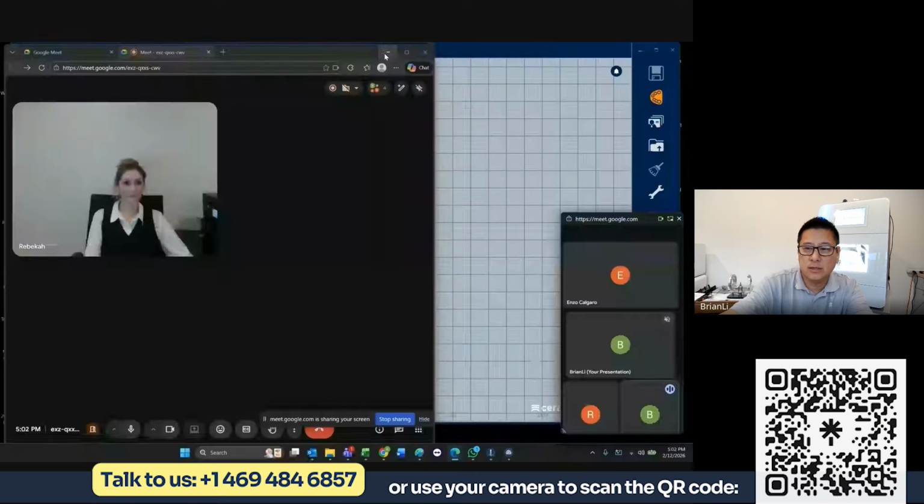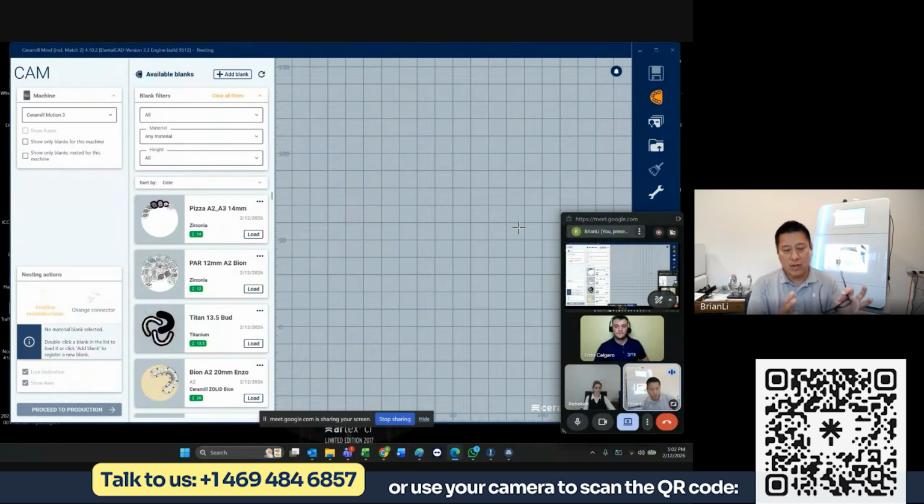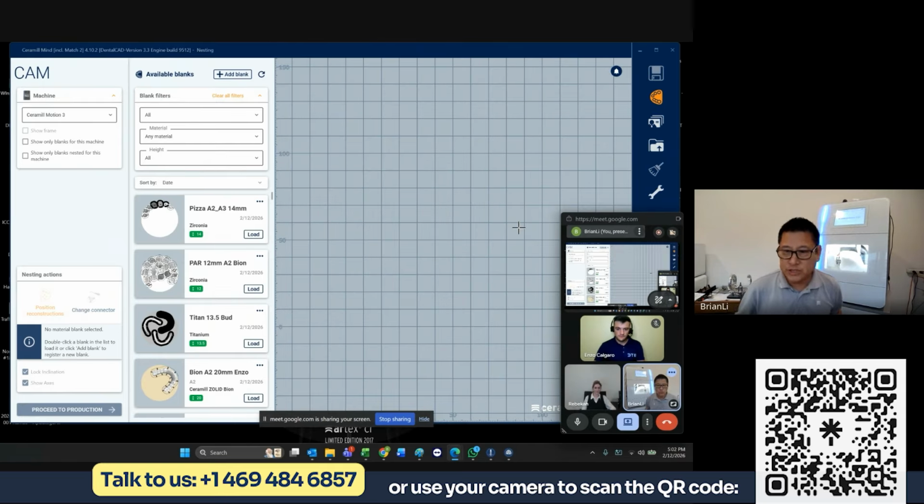All right. So what I'm going to show today is, basically, the workflow of how to produce the full arch cases in the AG system. I'm going to showcase a little bit of the things that we have. I will start with registering a puck.